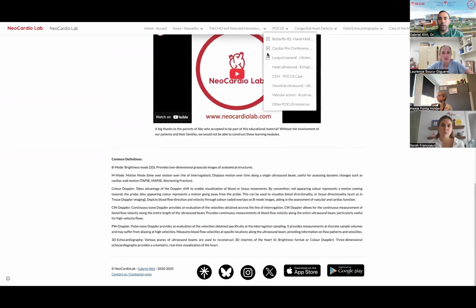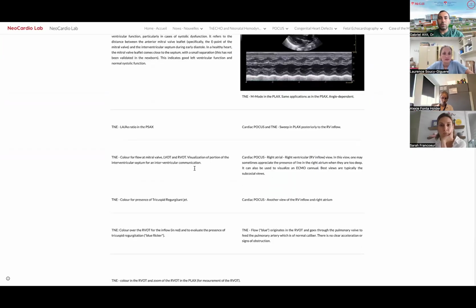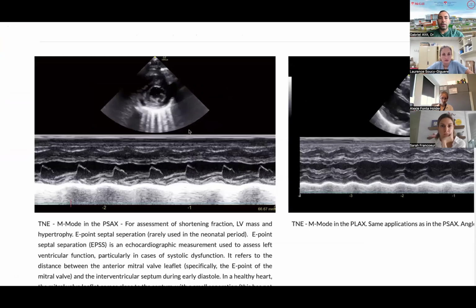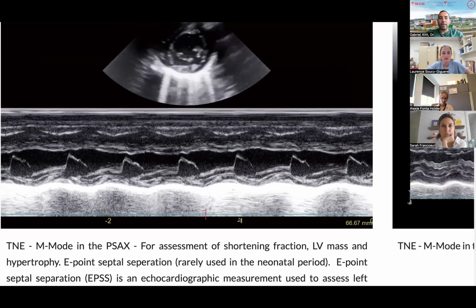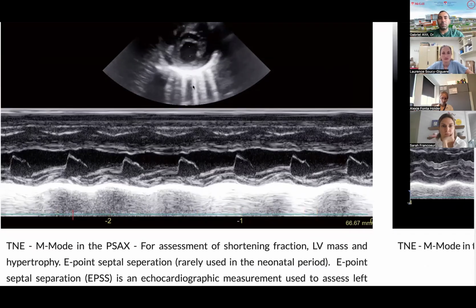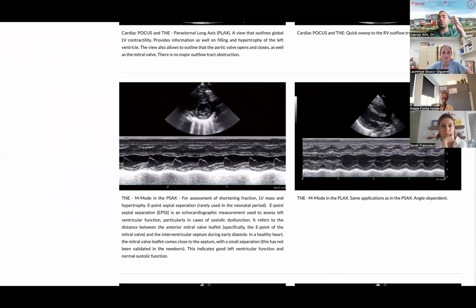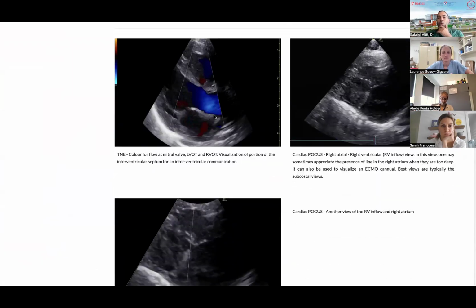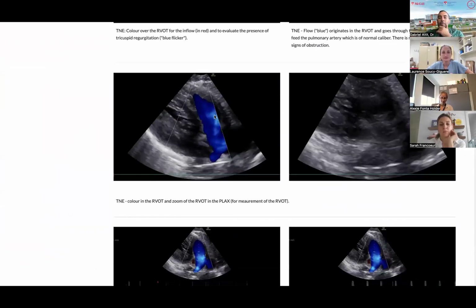I can actually try to show you on the GE Venue Go so you get a sense. Cardiac focus example. So this is in M mode. You see here, we're putting the line of interrogation, and as the time advances, it gives me whatever is appearing across this line of interrogation, and this is on the GE Venue Go. That's particularly important to see motion of certain structures, for example, or how far they displaced or moved around.